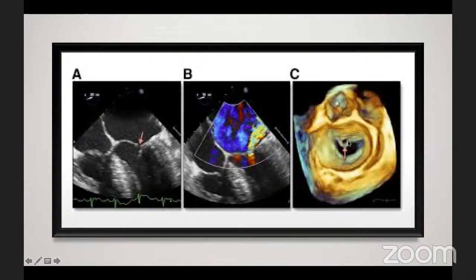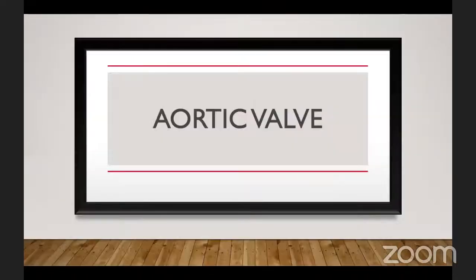mitral leaflet, and this is an anterior mitral leaflet. The reason why I said this is an anterior mitral leaflet in the 3D image is that I can see the aorta up in front of me in here. So this is the anterior mitral leaflet, and this is a perforation in the anterior mitral leaflet. And you can notice this is an eccentric jet going through that hole, maybe due to an infective endocarditis.